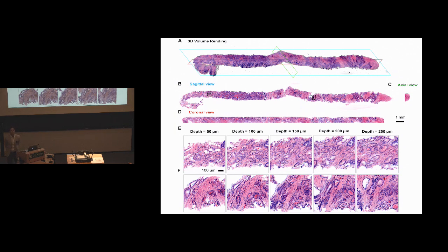Really interesting talk. I had a question about the microscopy for fluorescence guidance in the brain. Looking at protoporphyrin 9, once you start getting to the cellular level of protoporphyrin 9 expression, normal tissue also expresses protoporphyrin 9. So how do you distinguish at that small level what is normal tissue and what is tumor? Yeah, that's where we really need to have some quantitative image processing, and we're just starting to work on that and figure out if there are image processing metrics where we can distinguish different grades of tumors and different tumor cell densities. Presumably with the normal tissue, there's a difference. It's not going to be as high expression as the low or high-grade gliomas, and if we can quantify that effectively, then you can distinguish between the tissues.